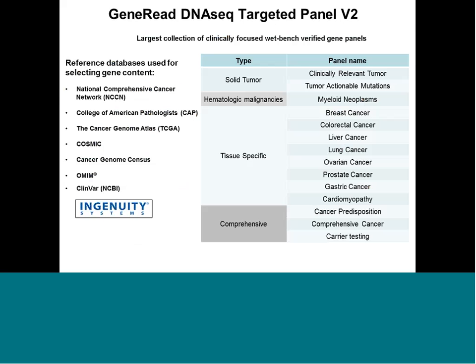Now, there are now very good reference databases, actually by the Ingenuity pipeline, to analyze large collections of tumor lesions. For example, by the National Comprehensive Cancer Network, by the TCGA consortium, by the COSMIC library. You can filter for every tumor you would like to analyze, like ovarian, lung, liver, BRCA genes, and so forth.